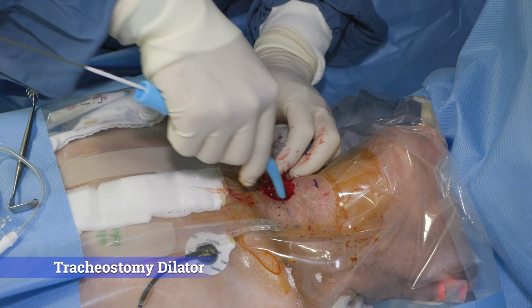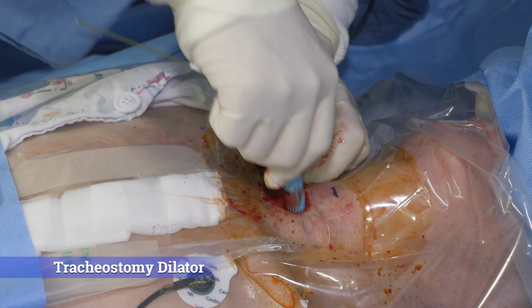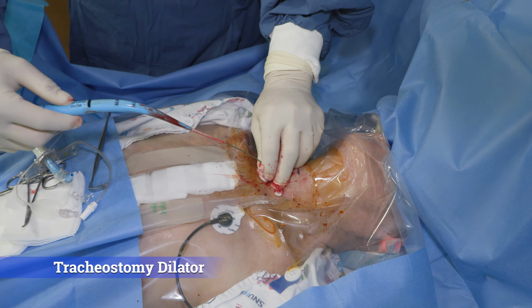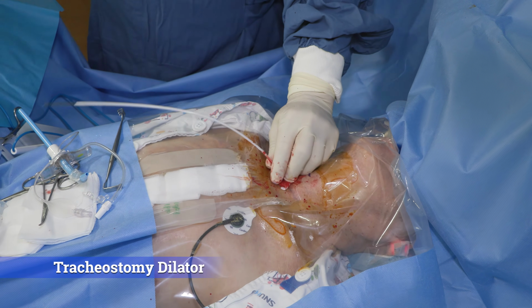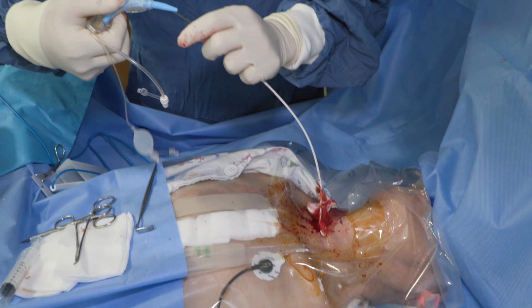Next, the tracheostomy dilator, which is curved and gradually tapered, is introduced. This tracheostomy dilator is inserted while assembled with a guiding catheter. When removing it, the dilator is withdrawn while leaving the guiding catheter in place.